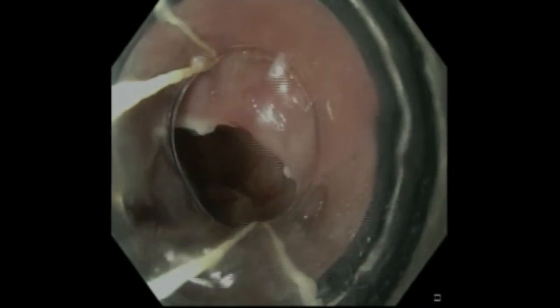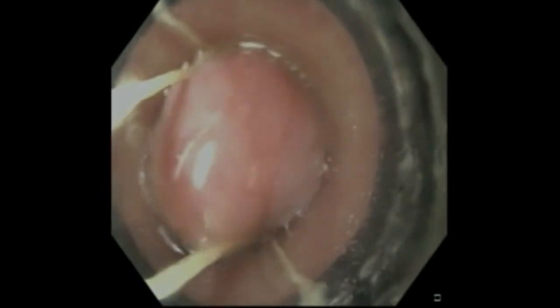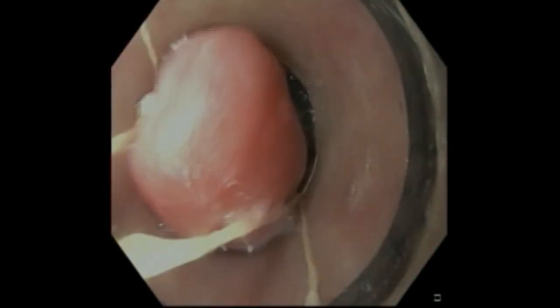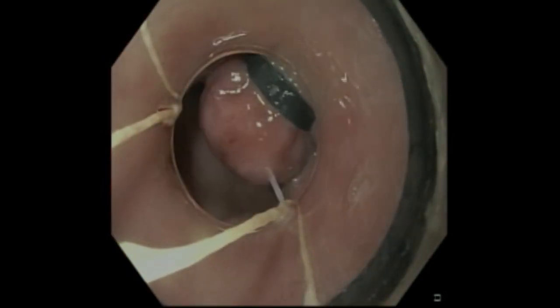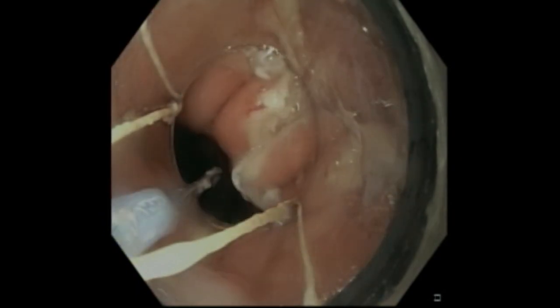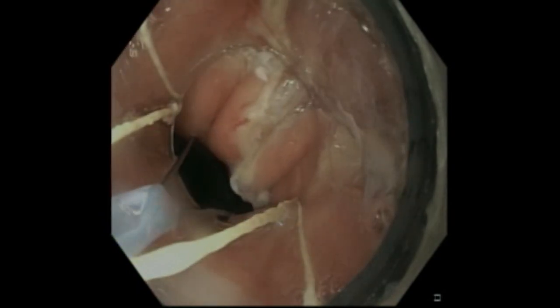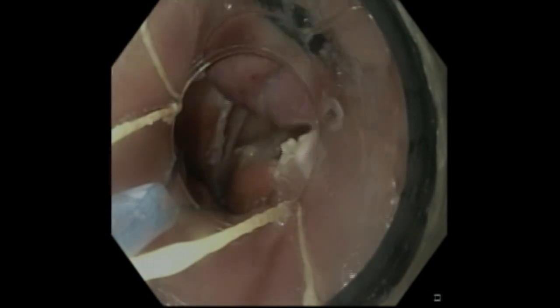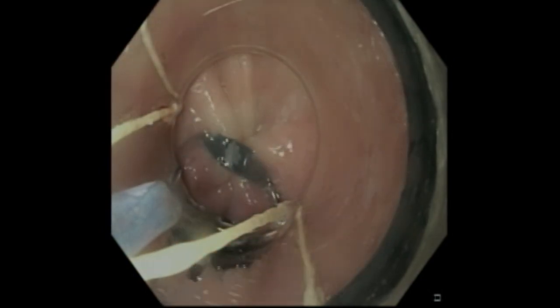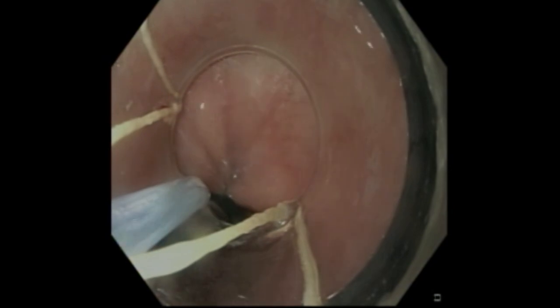You can then perform adjacent resections to enlarge the area of resected tissue. Here multiple areas have been resected in a so-called rosette-type pattern. We then resect the final abnormal area at the top edge of the lesion to ensure that all abnormal tissue is completely removed.